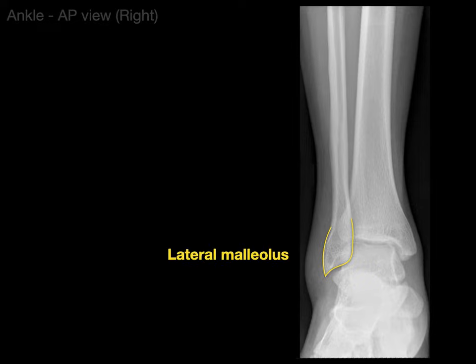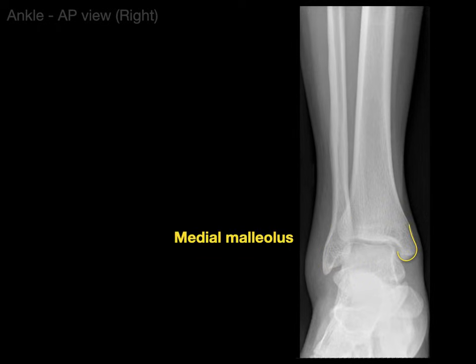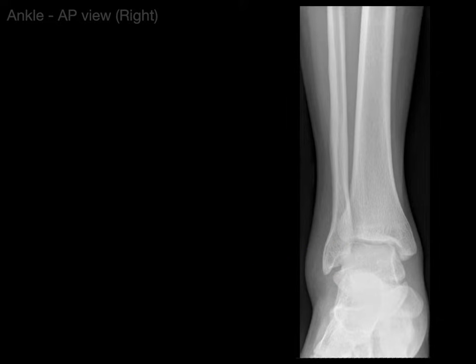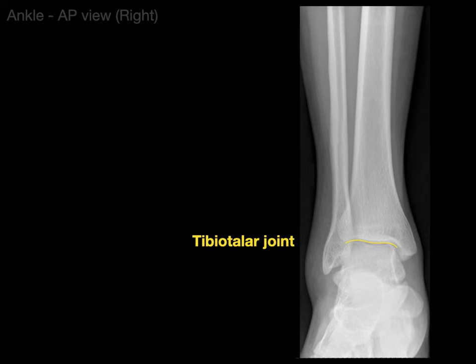That structure right there is the lateral malleolus, and that structure right there is the medial malleolus. Then that bone right on the very top of the foot is the talus bone, and the space in between is the tibiotalar joint, which helps give us our dorsi and plantar flexion movements.